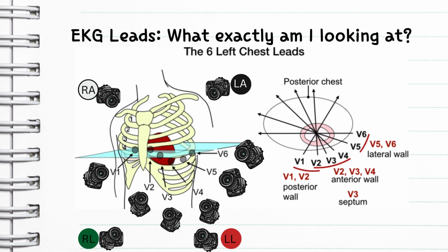So when it comes to cardiac monitors, most healthcare providers select lead 2 as the default view. When you see a heart monitor, you'll typically see one line of a heart rhythm, okay? You can tap on it and switch to a different lead. I don't know if you know that, but you can. Often they're preset for lead 2, and you might ask yourself, why is that? That is because lead 2 captures a view that aligns well with the natural flow of the electricity of the heart, particularly along the pathway from the atria to the ventricles. This angle is ideal for detecting common rhythms and arrhythmias, making it a legit reliable choice for continuous monitoring. Doesn't have to be lead 2, but that's typically what people choose.